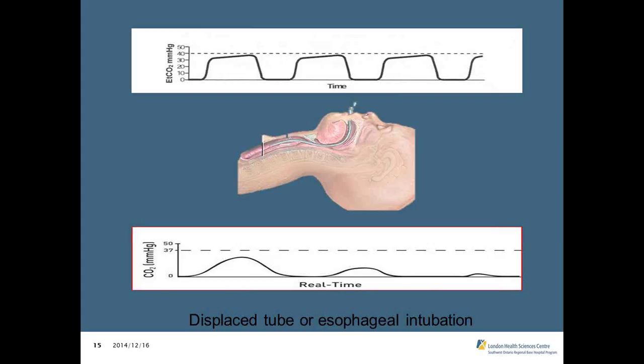So yeah, in terms of knowing that the tube's in the right place, this is probably your best indicator that you have a tracheal intubation. Again, when you're confirming the tube placement, you go through various steps to ensure that that tube's in the right place. And the reason why you need to confirm it in so many different levels is because none of those indicators by themselves tells you whether or not that tube is in the right place.